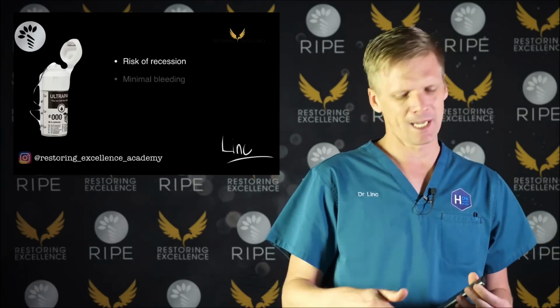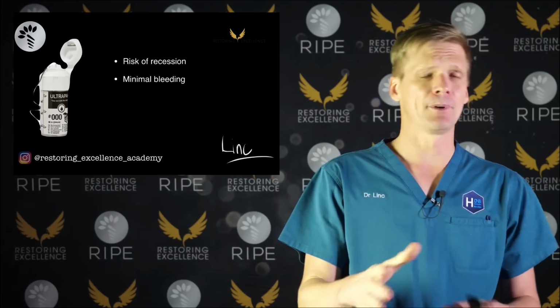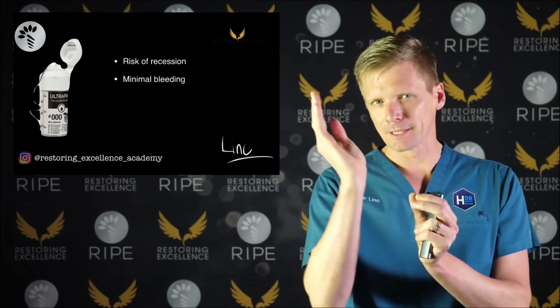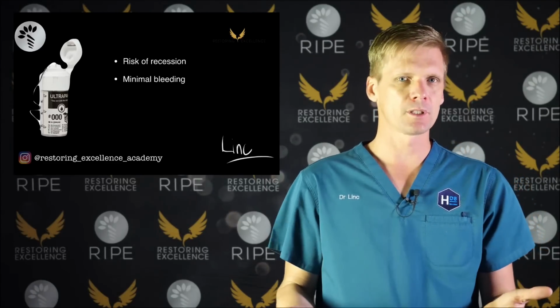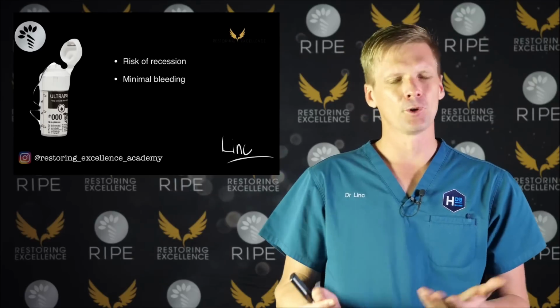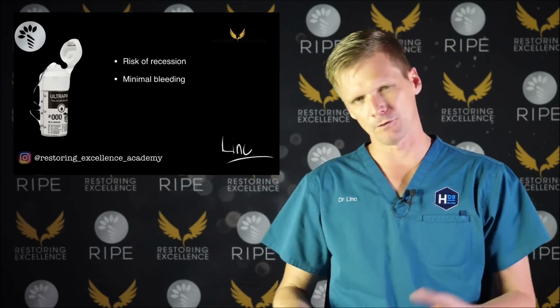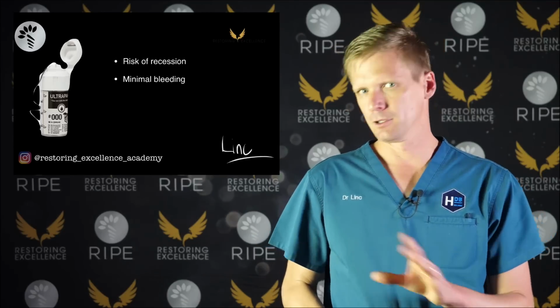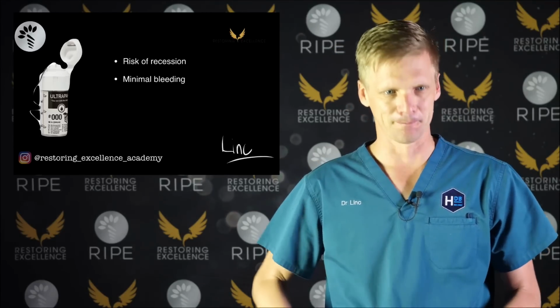So often with these cases, everything looks good and you get your air syringe and you blow high pressure air around the tooth and you get a tiny bit of blood coming up. And you know that you can't do a core while that's happening. For some of the easier crowns, I can put a rubber dam on, but a lot of the time, if you're doing a big case with 4 or 5 teeth, I'm going to do the core build-ups with no rubber dam. So we're going to do old school, cotton rolls and suction.